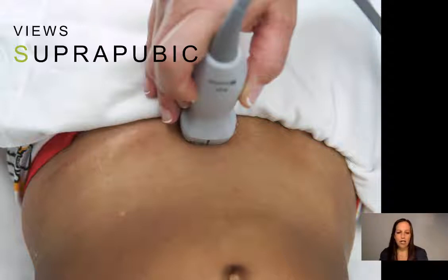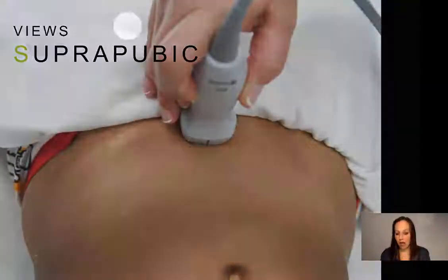Now, after you do the right upper quadrant and left upper quadrant views is the suprapubic view. This is particularly important in children. It is important to obtain two views. Now, to start with this view, have your indicator oriented towards the patient's right side and angle slightly into the pelvis.